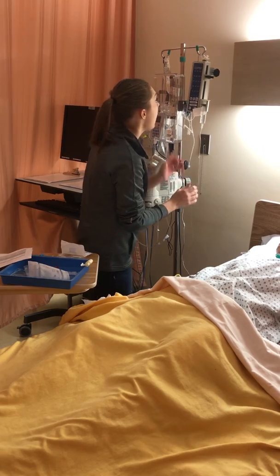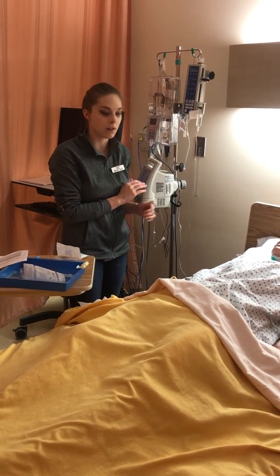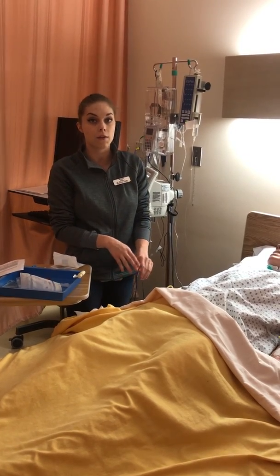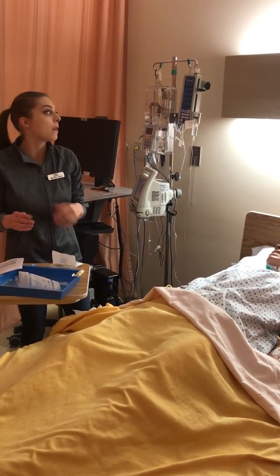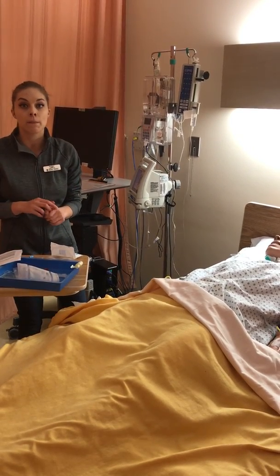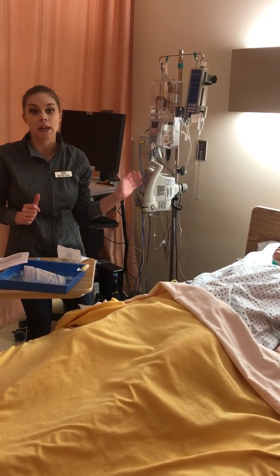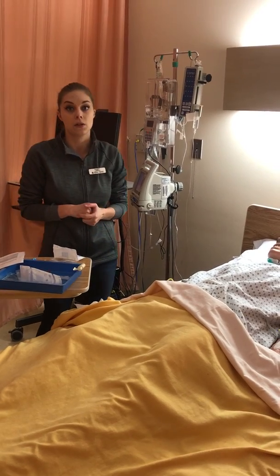I'm going to stay and watch the plunger depress to make sure that it's depressing properly and running properly, and to see that he's not getting any adverse reactions right off the hop. I will let the medication completely disperse, and then I will come back with a 3 milliliter normal saline, and I will flush it at the same rate as the medication so that all of the medication is through the line and into the patient.